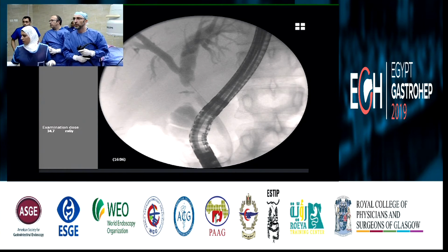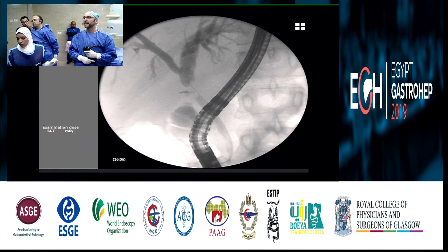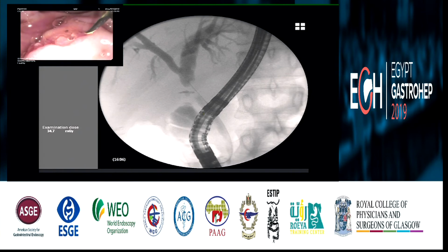So we usually treat these cases with multiple plastic stents with progressive dilation. But we have a very nicely dilated bile duct there, so it won't be a problem also to place a metal stent across.